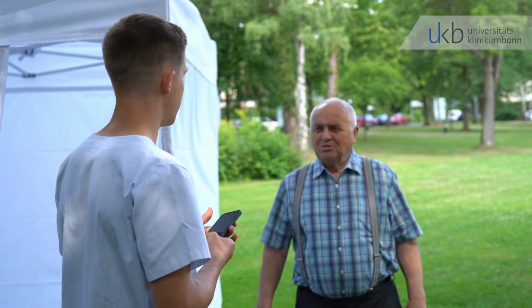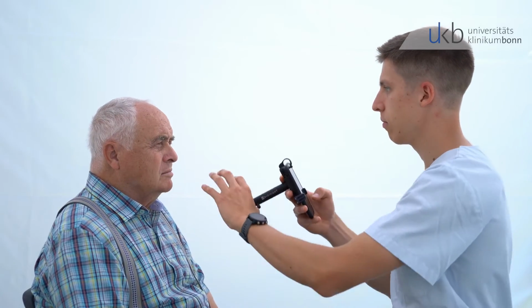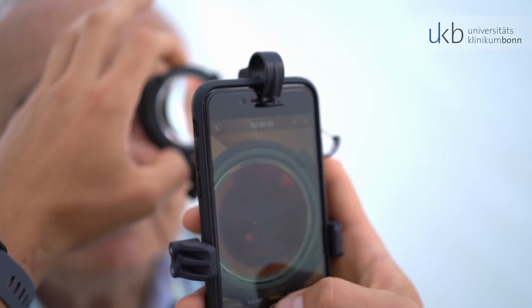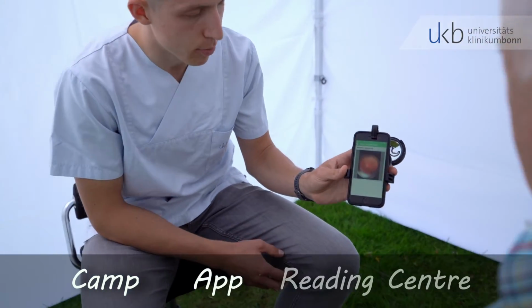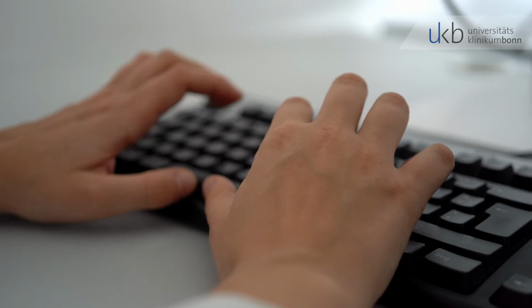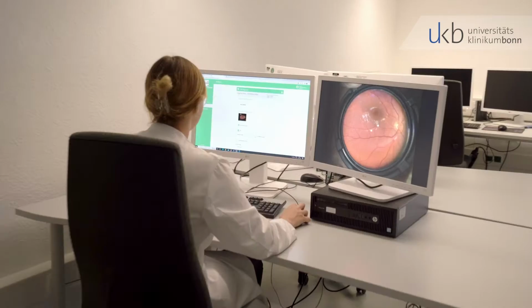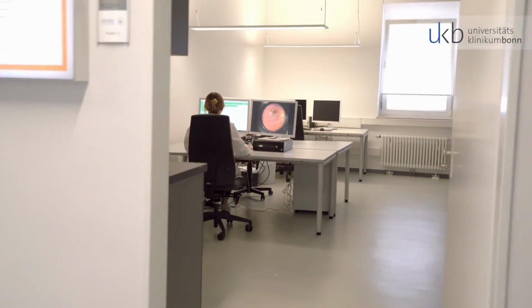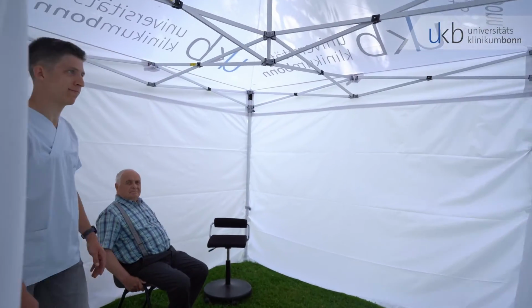Core element is the screening camp, where patients are examined not by doctors, but by medical assistants using imaging devices. In a telemedical diabetic retinopathy screening, the patient's retina is imaged with color fundus photography. Next, these images are transferred to the ophthalmologist via the internet using an app. The ophthalmologist will then analyze the images and determine presence and severity of diabetic retinopathy. The results and information on how to proceed are then transferred back to the screening camp, where the patient is informed by the medical assistant.